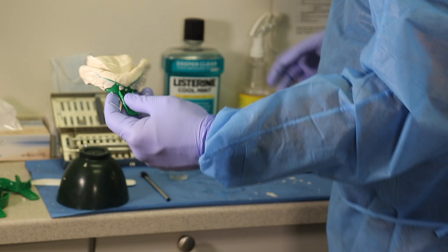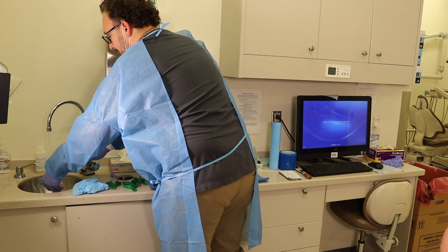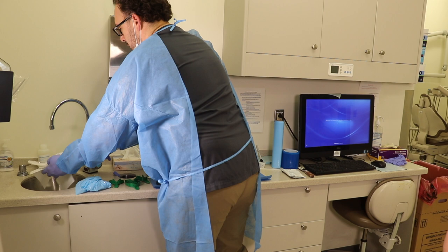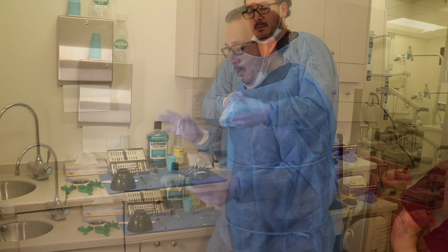Now, what do I do? Well, this one also has to be disinfected. Then I rinse it. I get two paper towels. I wrap it up. And it goes into the blue bag.